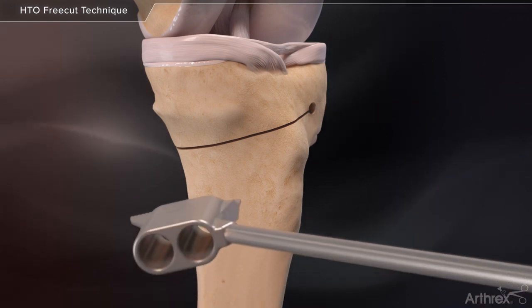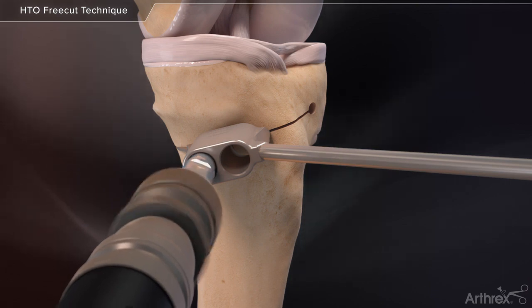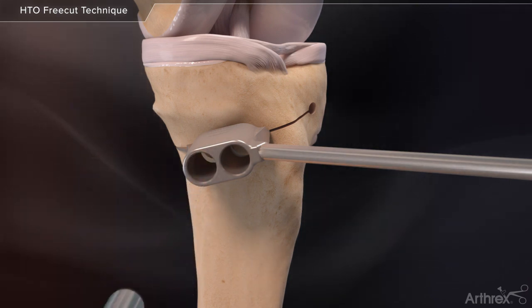Align the size-appropriate free-cut guide with the posterior medial corner of the tibia. Drill the 2 keyholes required for the i-Balance HTO implant.